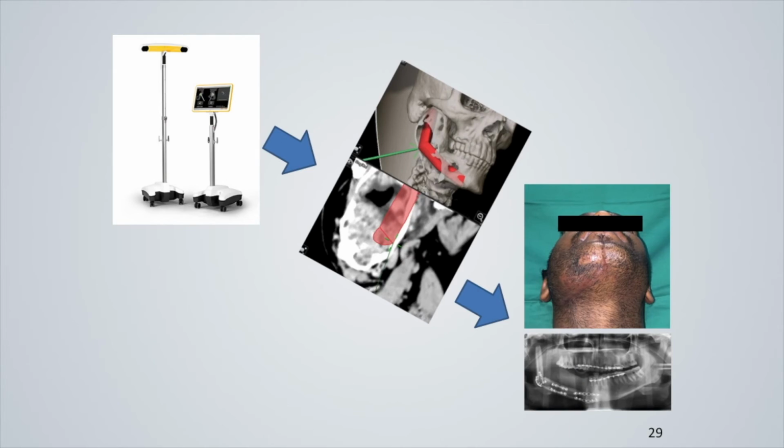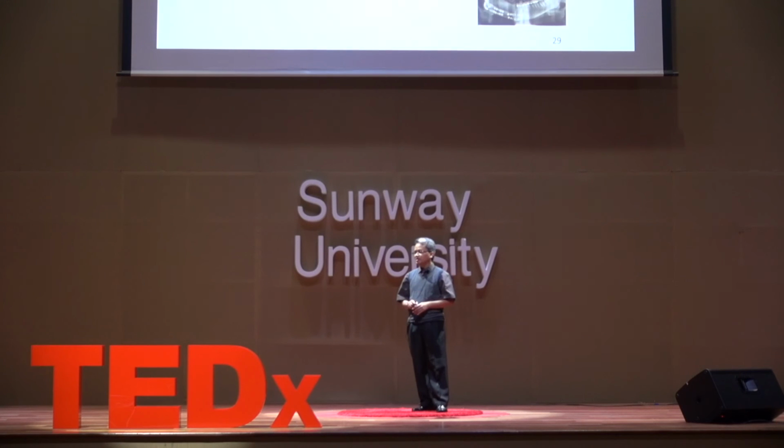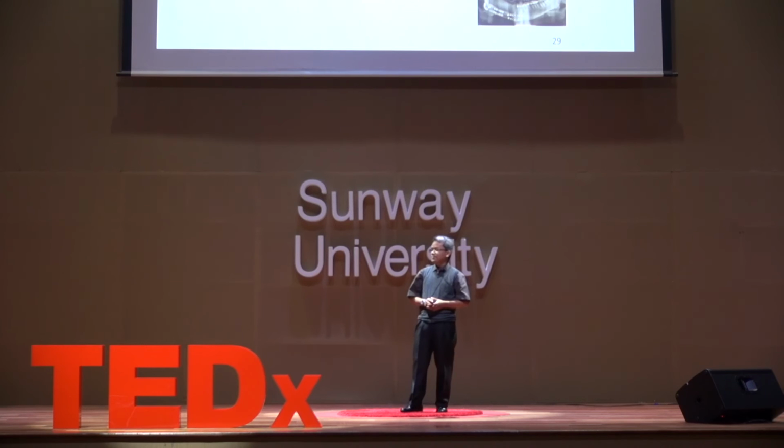So in the surgery, we have the template side by side with the bone that is from the leg. And with the use of this little robot here, we can determine, especially the angle of the jaw, where this is the area that is very important for us to maintain the continuity of the jaw as well as to maintain the symmetry of the jaw. And we have this at the end of surgery, normally at about 6 to 8 hours after the surgery.